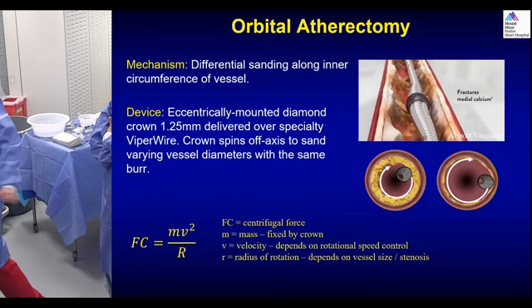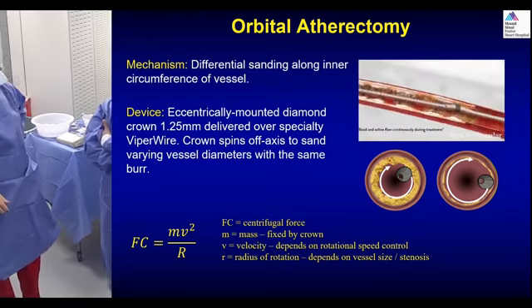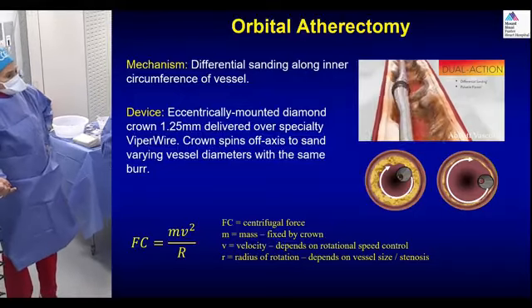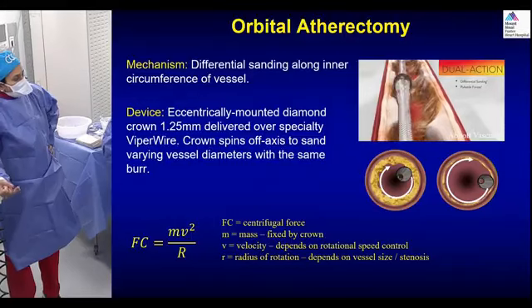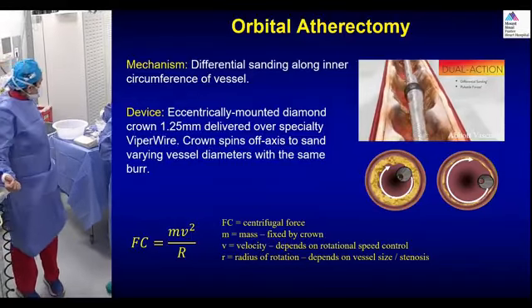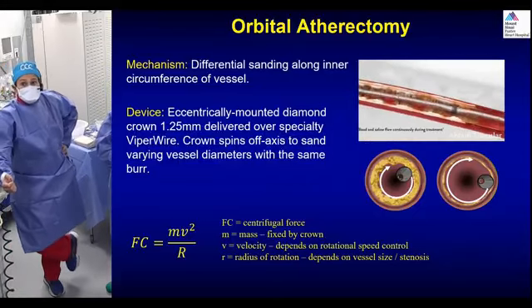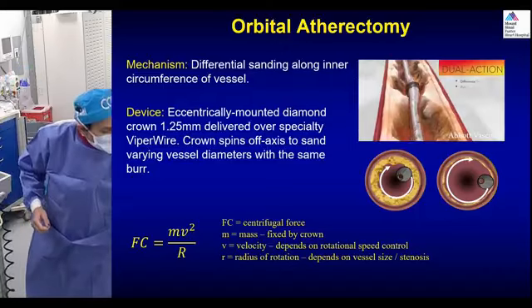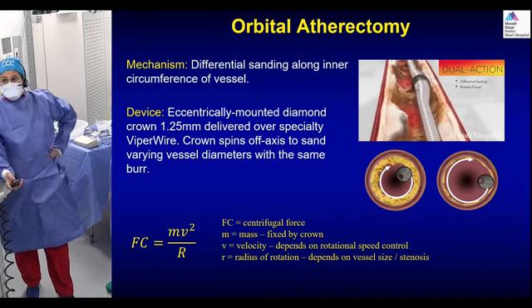So the other question is, what is the rota solution, or what do we use? It is half normal saline, where you put nitroglycerin, then verapamil, as well as heparin and some Rotaglide solution. They always ask the patient if they are allergic to eggs or olive. I don't know about the olive, but there is an emulsion apparently that they use. They ask the patient if they are allergic, otherwise they use it.